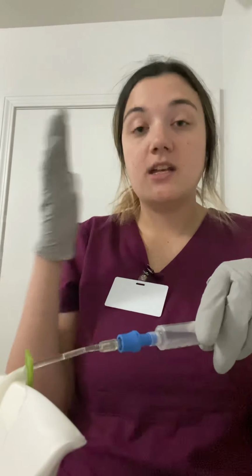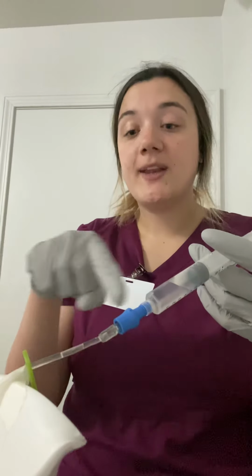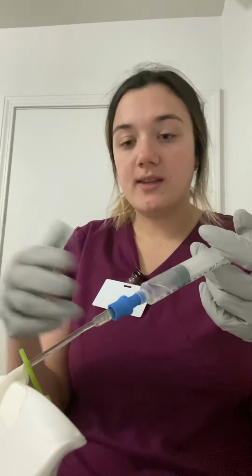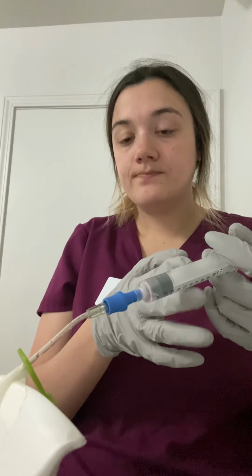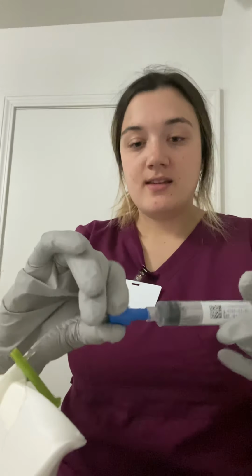I unclamped it, and you want to do it over 2 minutes, the same as the medication, because you are now moving that medication through the line, and you need that to be moved at the same rate. So again, no speed shock or anything like that. So over 2 minutes, I have now pushed in 4 mils, and I will now clamp this back.